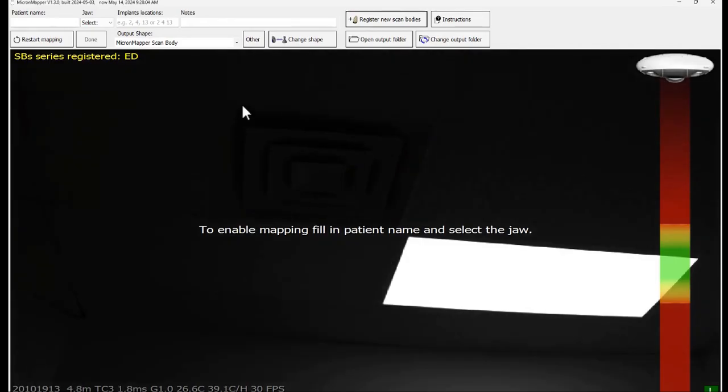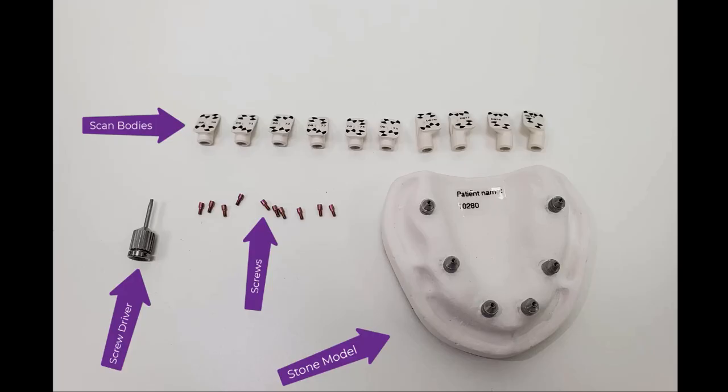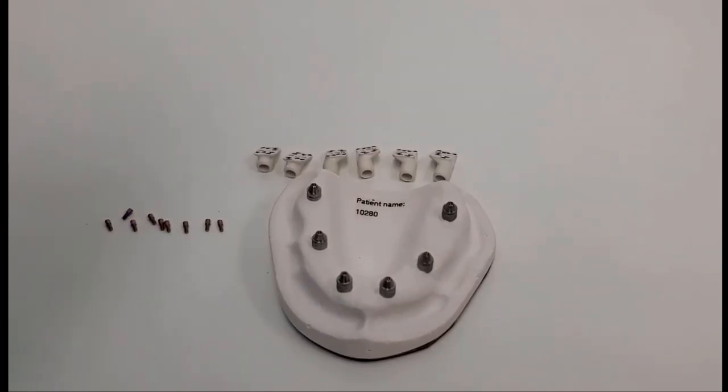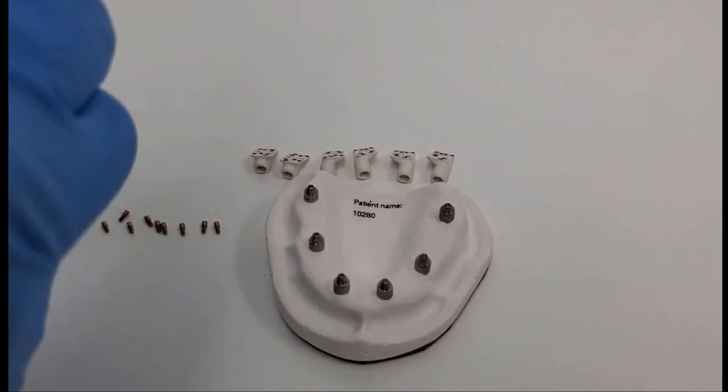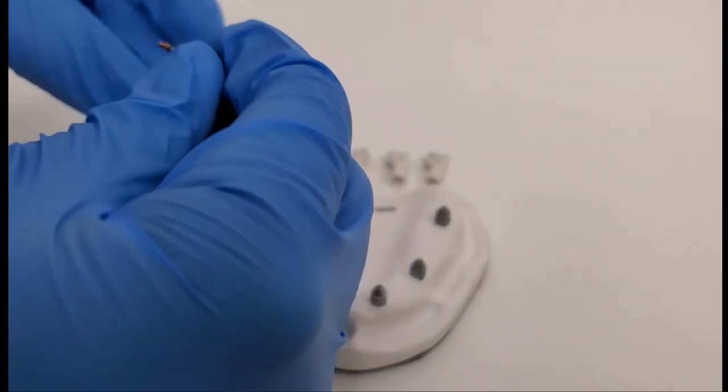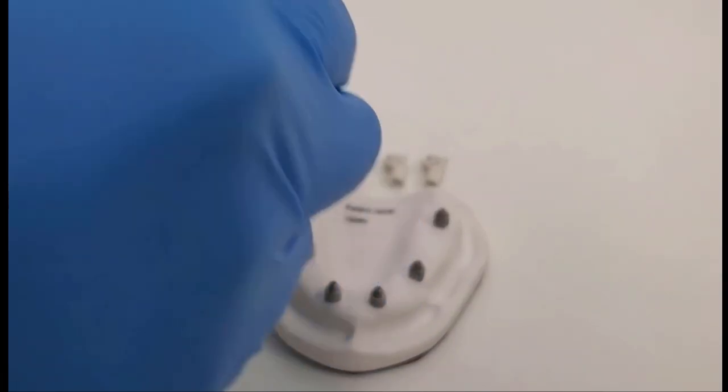Moving on to the scan bodies, there are a total of 10 scan bodies in the package. A stone model, the screws for the scan bodies, and the screwdriver tool to affix the scan bodies to the stone model. Grab six scan bodies and affix them to the MUA analogues in the stone model with the help of the screwdriver.